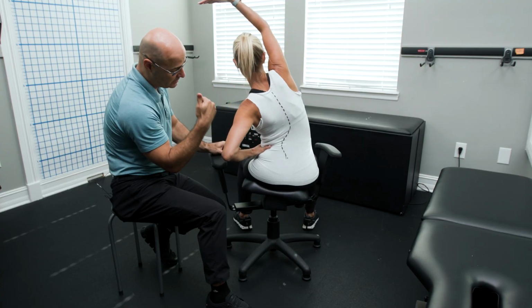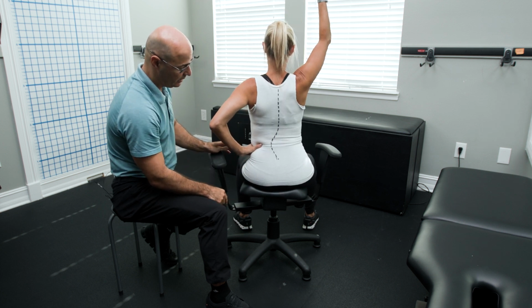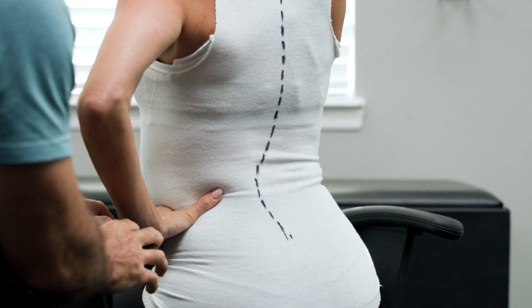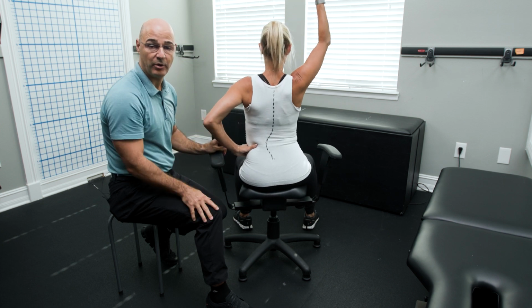And she's going to flex towards me, and she's going to really try to open up this area and come back to neutral. Good, and really flex over. And she tries to use her hand to increase the force in that area and pivot over that. Okay. And of course, this is prescribed uniquely for that particular patient.